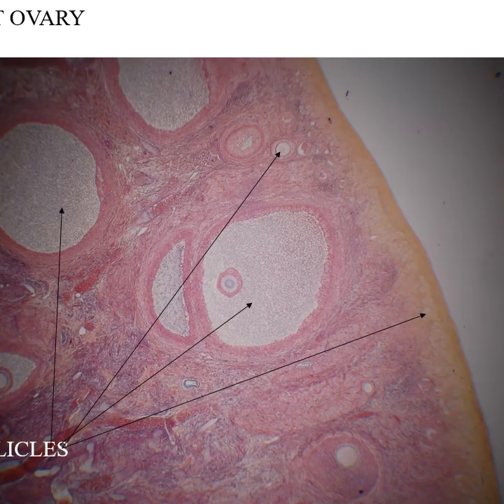Now, this is an ovary. We'll look at this some more when we do the female reproductive system. For now, I just told you identified as the ovary, secretes the two female sex hormones, estrogen and progesterone, which target primarily the inner layer of the uterus, the endometrium, to prep it for implantation of a fertilized egg.